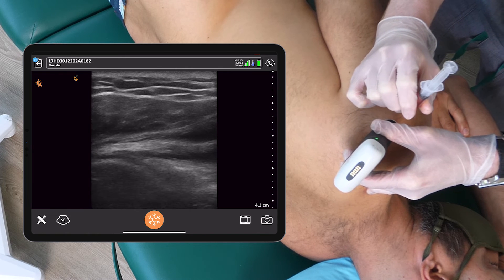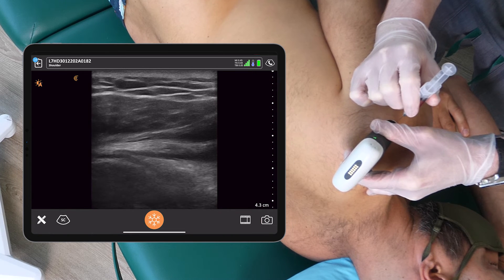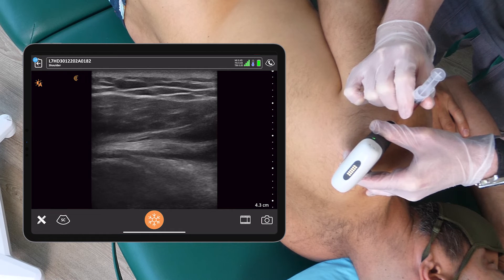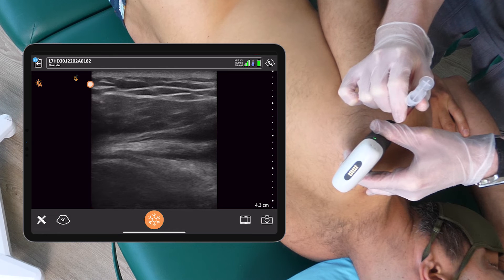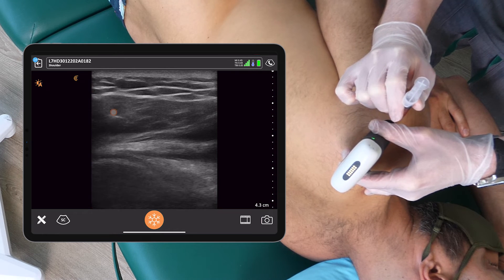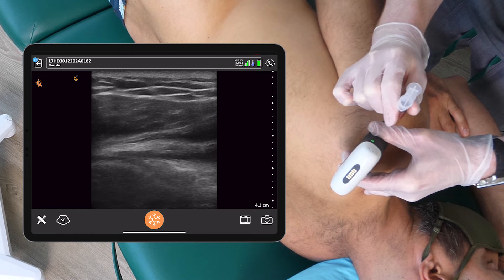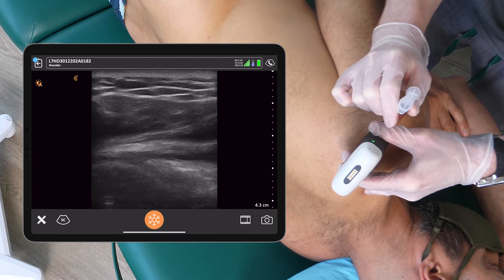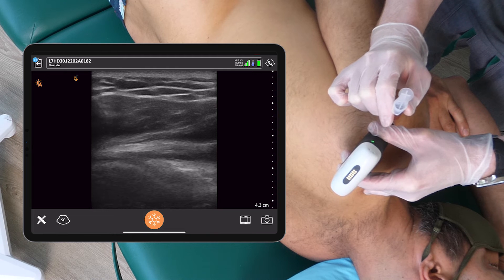This injection is performed often more steep than most physicians realize when they begin injecting shoulders. Very often we have to take a few tries at injecting this area to make sure that we're being so delicate with the labrum and soft tissue in and around the joint.